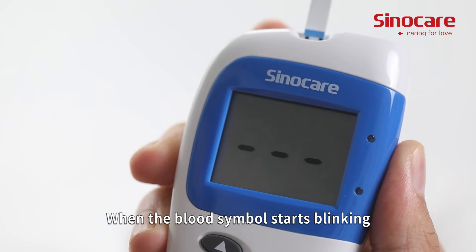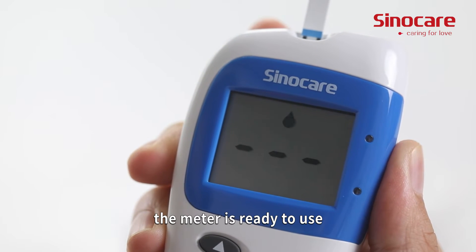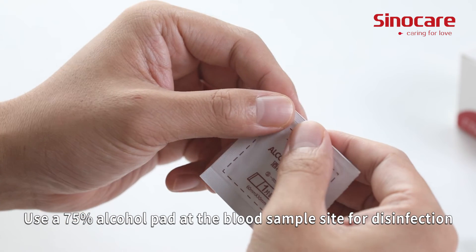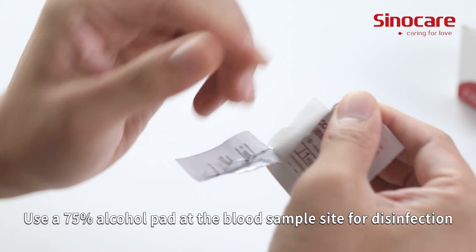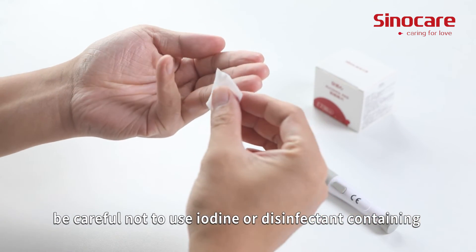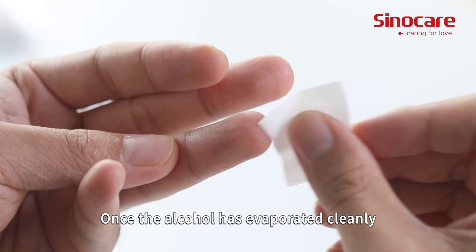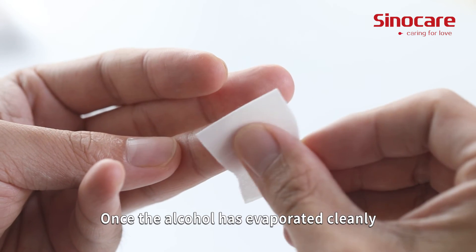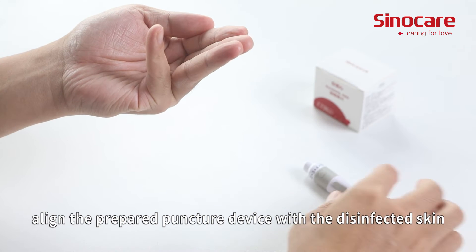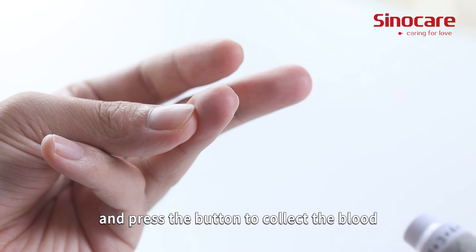When the blood symbol starts blinking, the meter is ready to use. Use a 75% alcohol pad at the blood sample site for disinfection. Be careful not to use iodine or any disinfectant containing iodine. Once the alcohol has evaporated cleanly, align the prepared puncture device with the disinfected skin and press the button to collect the blood.